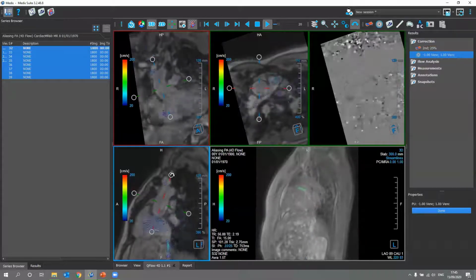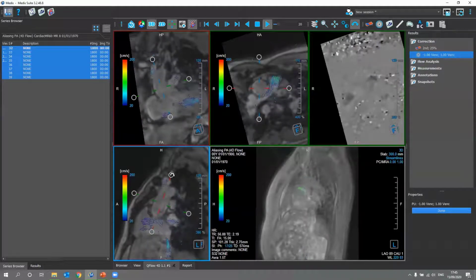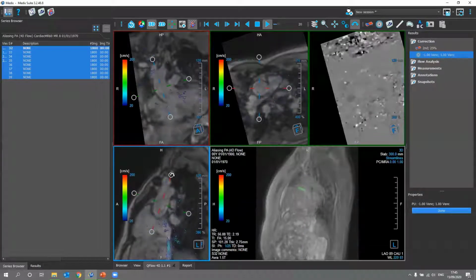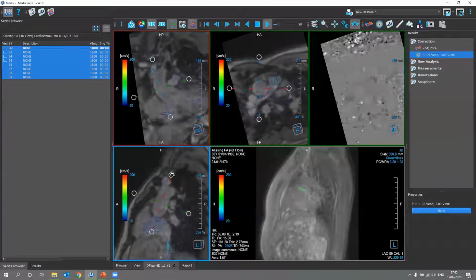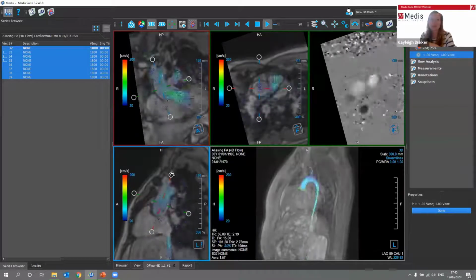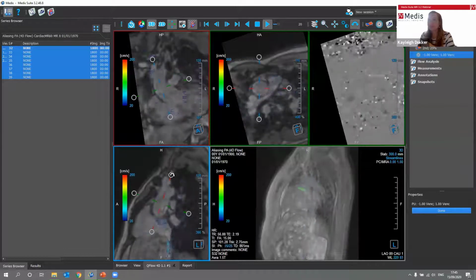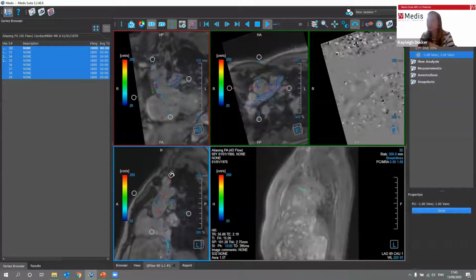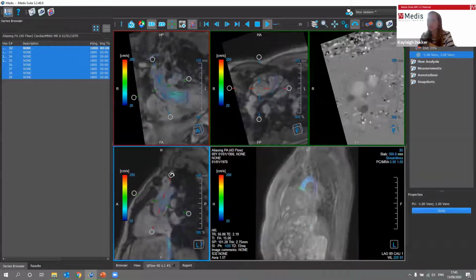Now there's another question, this one for 4D flow. What is the preferred background phase correction and is it necessary? So another good question. So the background correction is like in 2D flow applicable to certain vendor types.